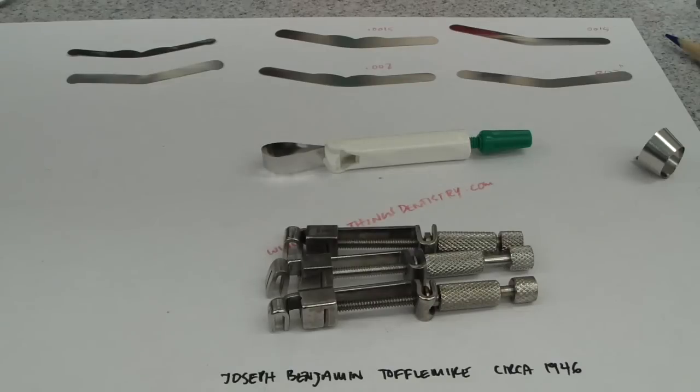Folks, Ashley at AllThingsDentistry.com. We're talking about Tofflemire Universal Matrix Systems for amalgam placement, and the reason why I'm talking about this is that a number of viewers asked me for some tips and hints on complex amalgam placement.